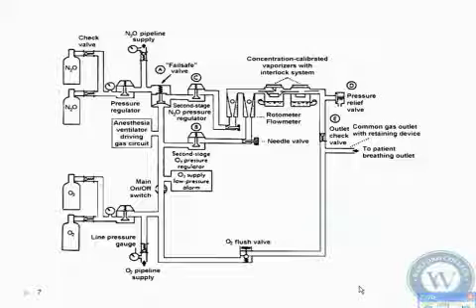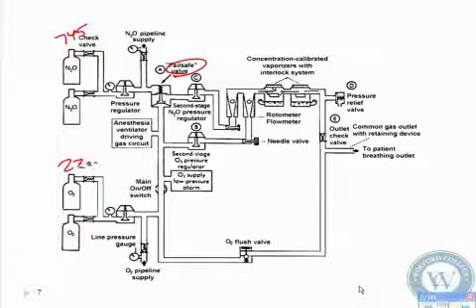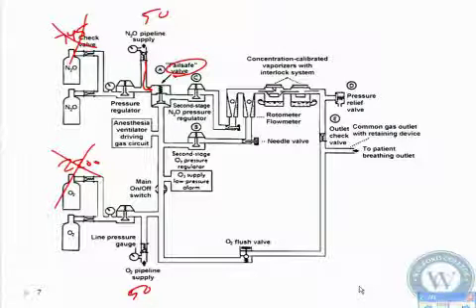All right, so on this, I just want to show how this fail-safe valve works. So this is the fail-safe valve. Our pressure here is at 745. Pressure here is at 2200. This is 50. This is 50. Okay? So we're not using this under normal circumstances. So here we have nitrous oxide coming in, but it can't enter right now because this is closed. So our O2 molecules are going to come in, and they're going to come up to this point here, and they're going to force this up.